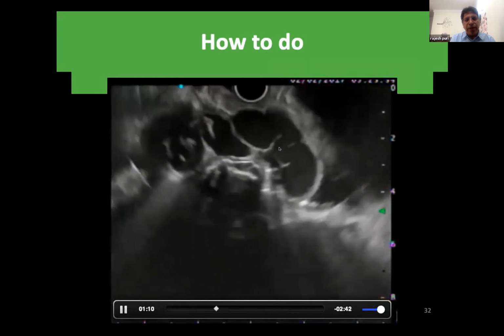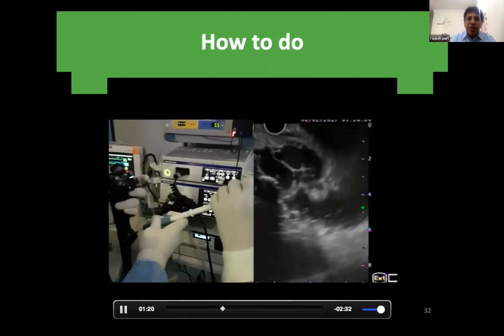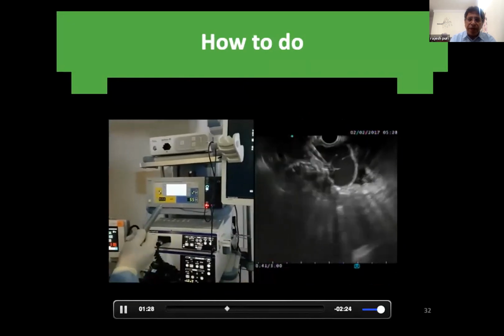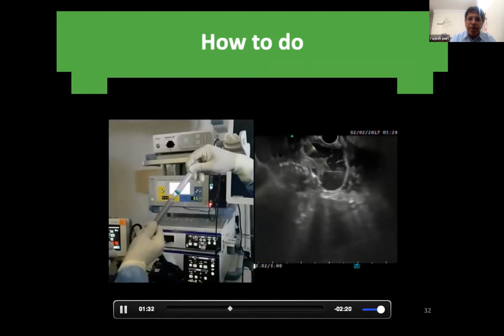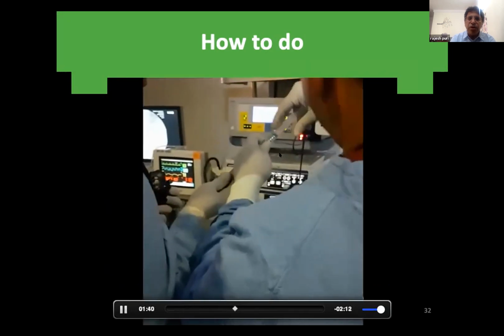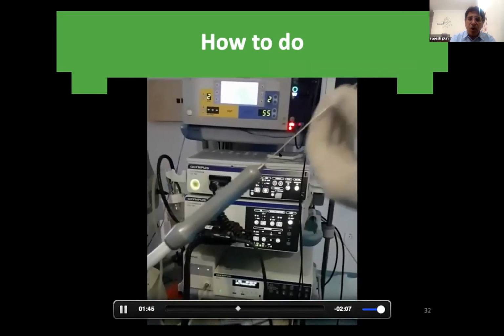The diameter of the varix was measured. Both the longitudinal and the oblique diameter were measured. The 19G needle was attached to the scope hub, which is already primed with 5% dextrose or distilled water. I puncture. Confirmation is by drawing the blood. You see that by giving negative suction, the blood has come into the syringe. Flush the needle again because blood is inside the needle. Then attach the coil.